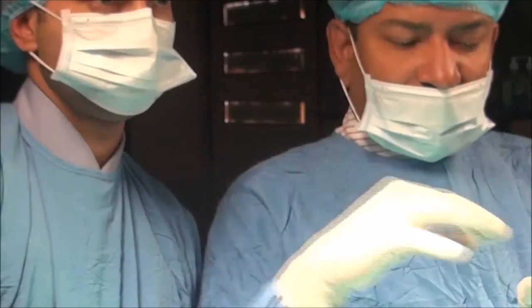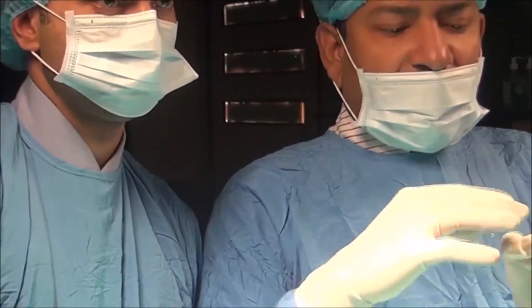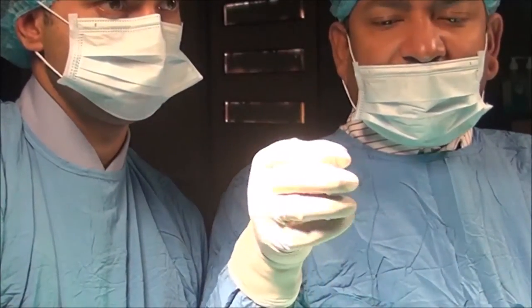Hello, today I am going to demonstrate the tumble square knot. This is one intracorporeal knot which is used for tissue which is under tension.